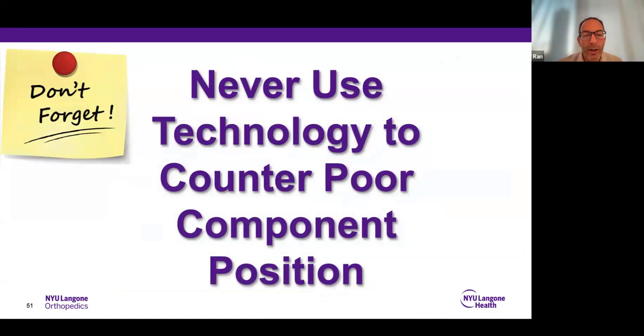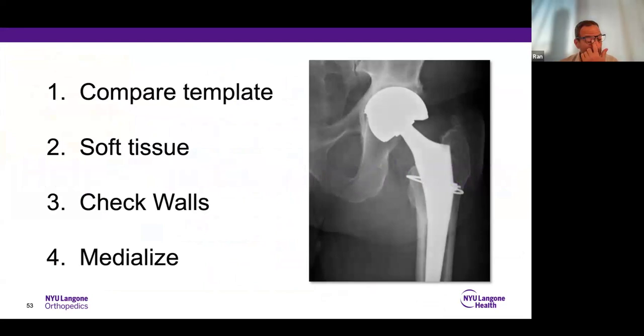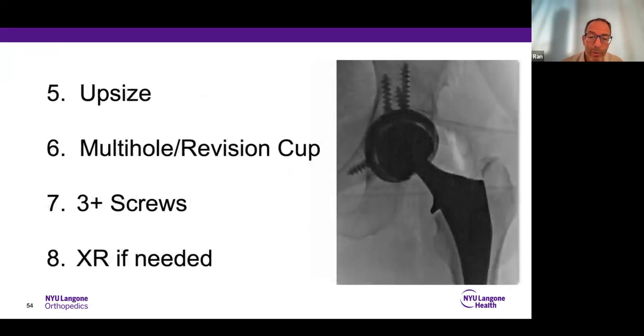The most important thing is where you position your implants. Just using different bearings and different head sizes doesn't solve that. When you're doing hip replacement and you're doing the acetabular cup, you want to make sure that the acetabulum fits inside. You want to make sure you didn't ream out the walls, or you don't have soft tissue impingement, in order to get that acetabular cup to be in there.